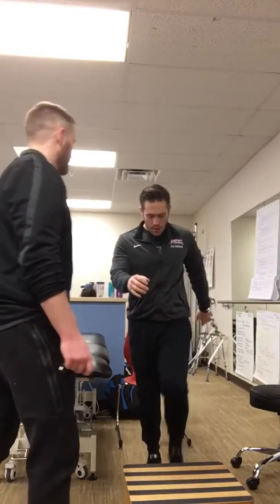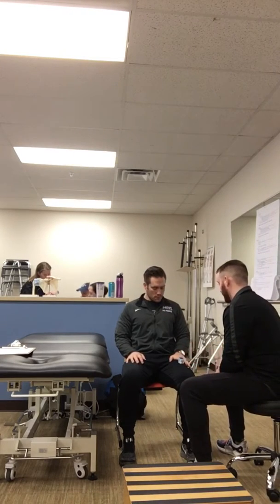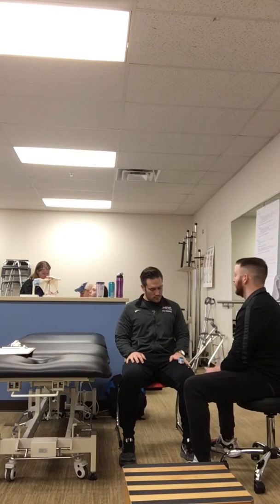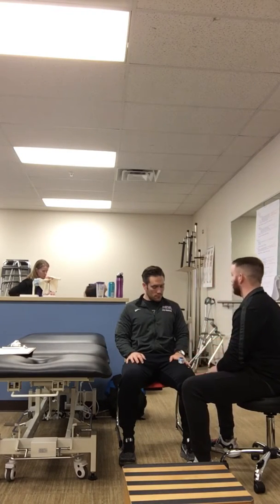All right, good. You can go ahead and sit back down for me. Okay. I'll get this right away on you while I'm getting your respiratory rate. Oxygen 94, so we want you up in that 95 range. In this instance, I would have the patient relax a little bit and focus on some breathing techniques, making sure you're able to get back up to that 95. Heart rate's looking good, 90, dropping back down as you're recovering.